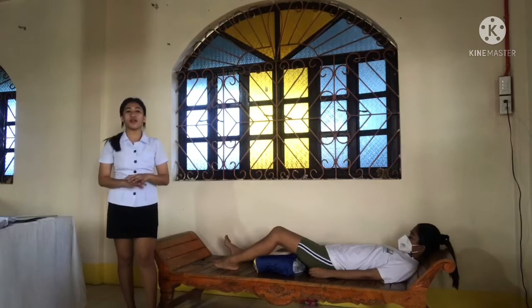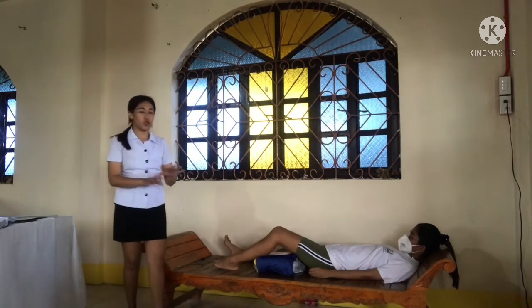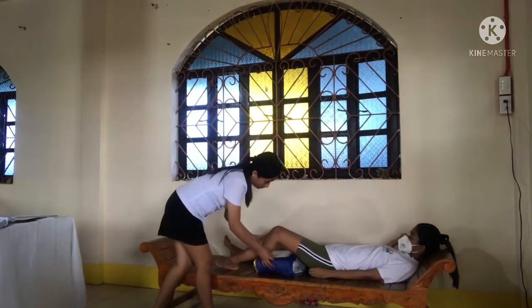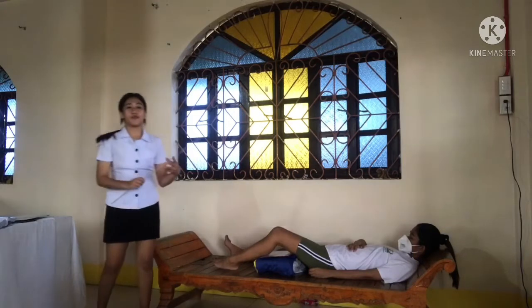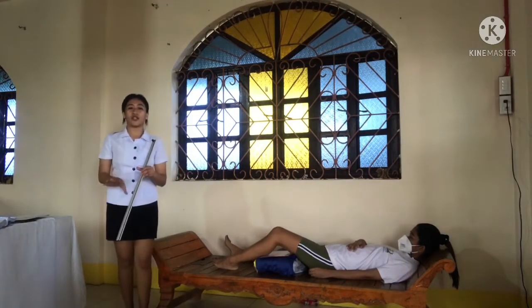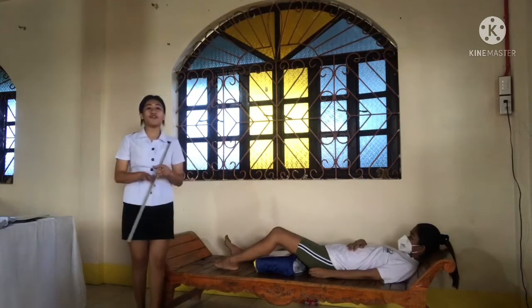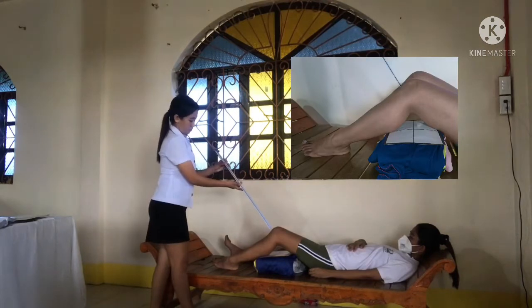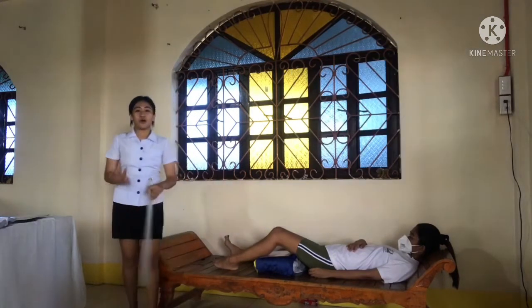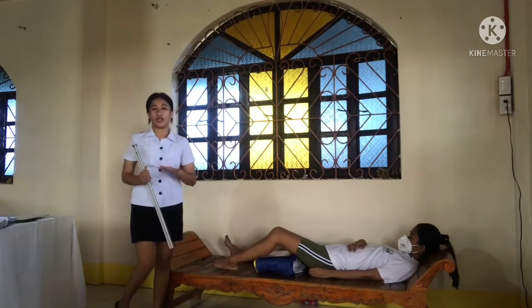So, adjust the leg so that the femoral condyles are equidistant from the IR. Immobilize the foot with sandbags. So, the central ray for this projection is perpendicular to the long axis of the tibia, entering the knee joint 1/2 inch below the patellar apex. So, this shows the intercondylar fossa, intercondylar eminence, and knee joint.